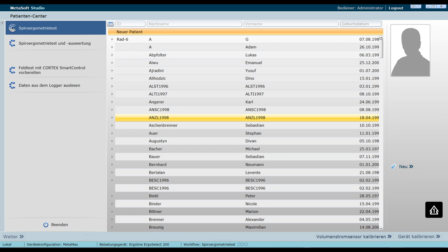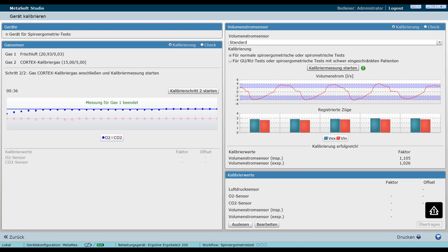The first window shows the patient center. The first step is to calibrate the unit, starting with the volume flow sensor calibration. To do this, press 'Calibrate Device' in the software. Then a window opens where you should press 'Start Calibration Measurement'.